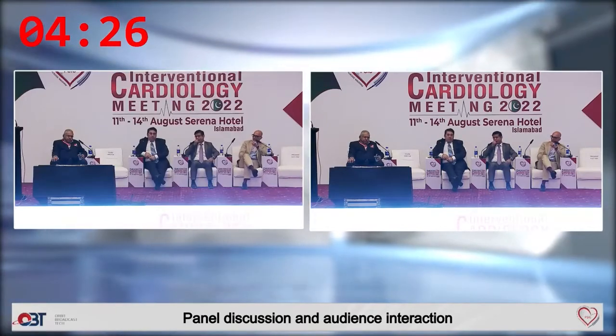Usman? So, yes, I think fantastic outcome. Your choice of position one versus two, I think one for the transcaval puncture, I think the degree of calcium there was probably too much to get the wire through, and also the separation was at the upper end of what is possible. Kudos to you for going through the aneurysm, and it turned out great. But looking at the CT scan, the dense calcium and the separation between IVC and aorta was probably the reason why that wasn't a suitable point to cross.